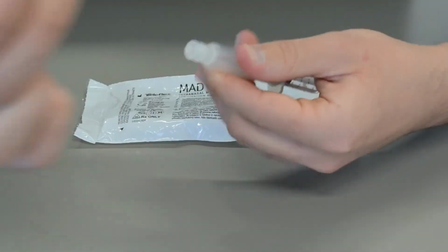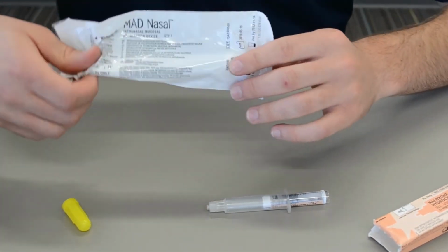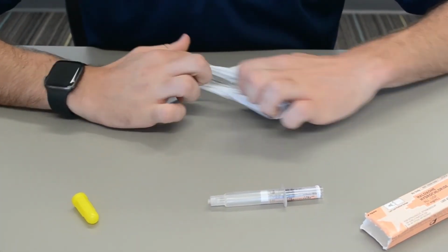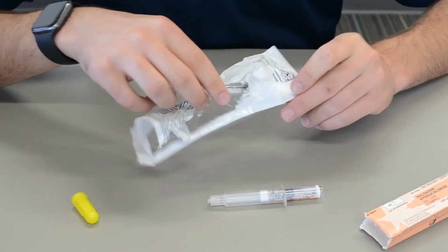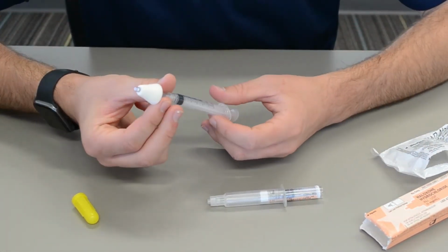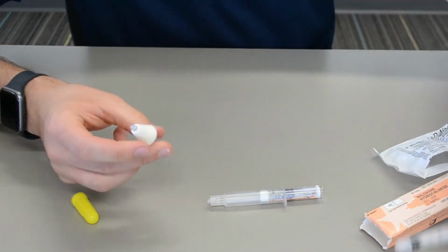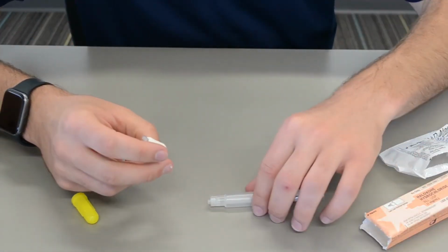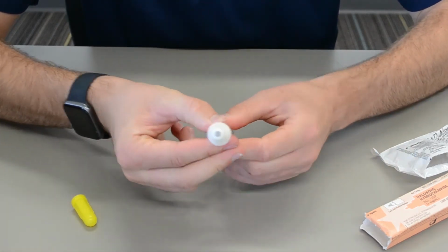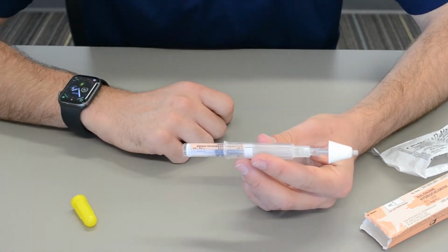Now we take this cap off and we move to our other piece of equipment that we need. In order to give this medication IN, intranasal, we're going to need what's called a MAD, a mucosal atomizer device. So this is how they come. It's got a 3 cc syringe attached to it that we don't actually need because our medication's already in this vial. So we just unscrew the device from the syringe, set that off to the side, and then reattach the device onto our Narcan, and there we go. We're good to give our Narcan.